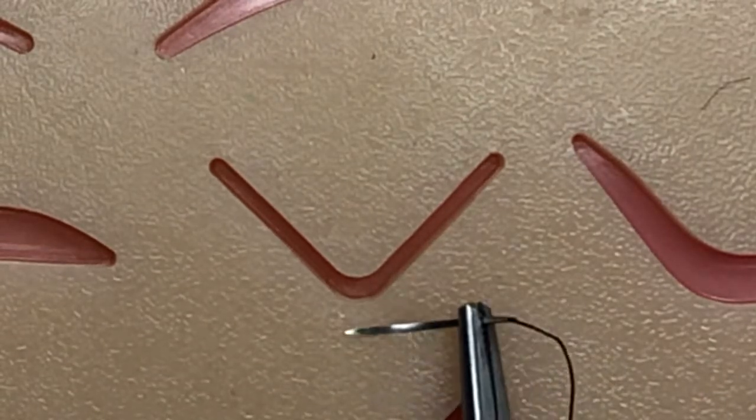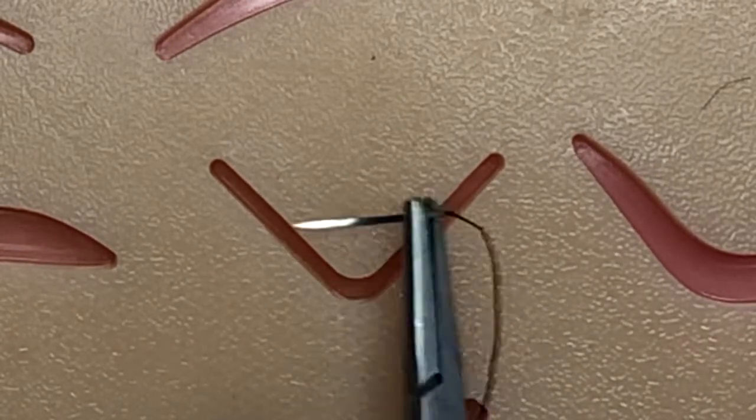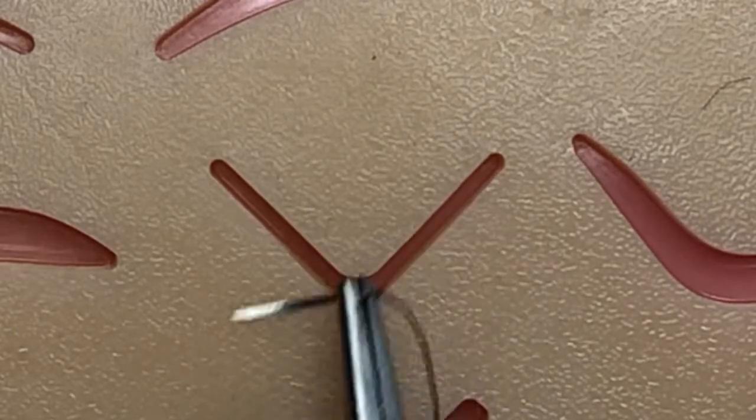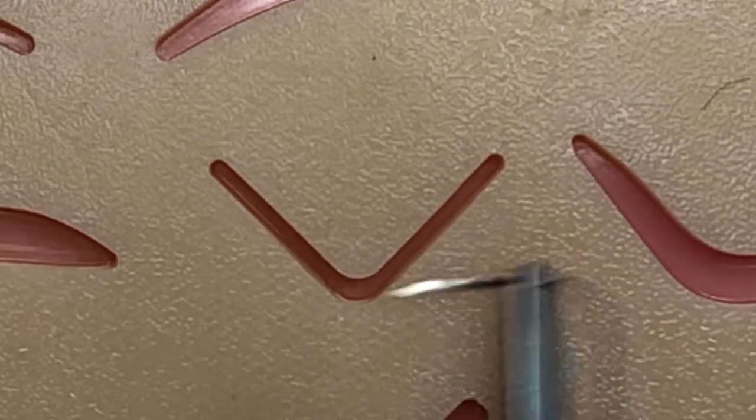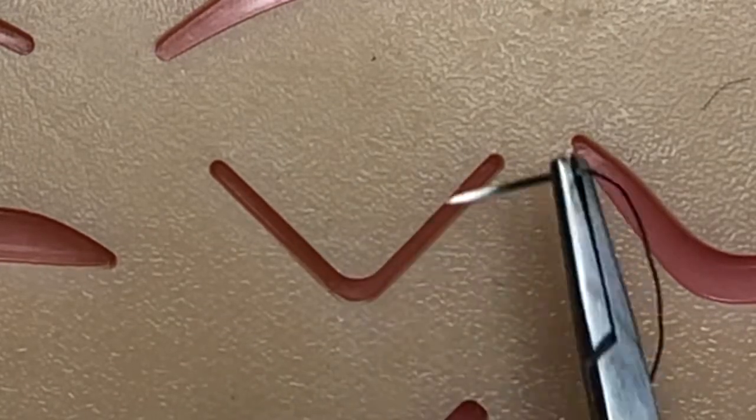And I think that it's always important to tie your knots on the area, not the flap, on your area with a greater blood supply, the dominant area of the wound and not the small flap.